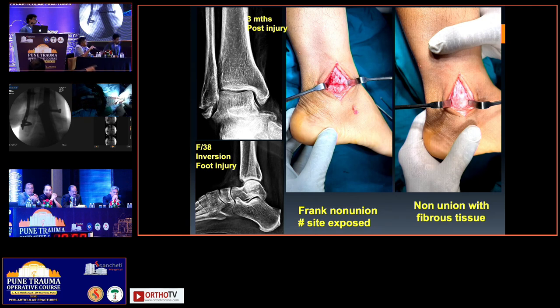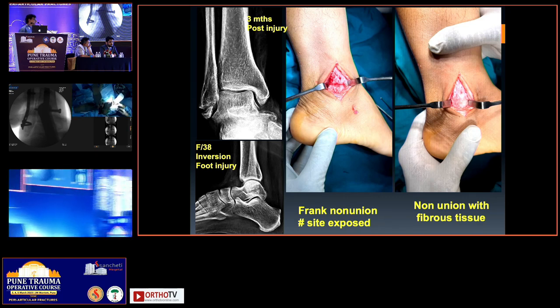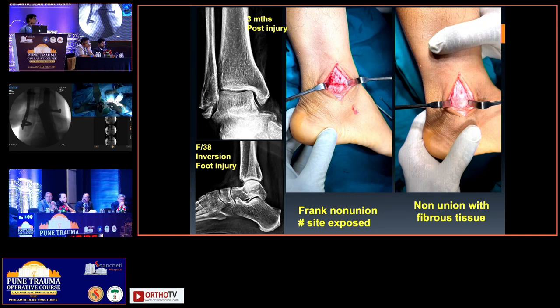Is there any other way of evaluating this angle? Yes, so the simple way is to see him standing. So many times these patients have a varus heel, and they keep on stressing the lateral part. That is physiological for them, but they have varus in standing position, and then they keep on stressing the lateral part. That is why they heal with lengthening or go into non-union, or something is wrong in the subtalar. See, I'm not very happy with the AP view, the subtalar, the way it moves. Of course, now it is only symptomatic at the fibula, but we are discussing why an infrasyndesmotic fibula should trouble him.